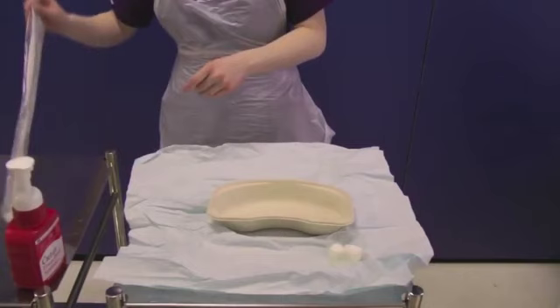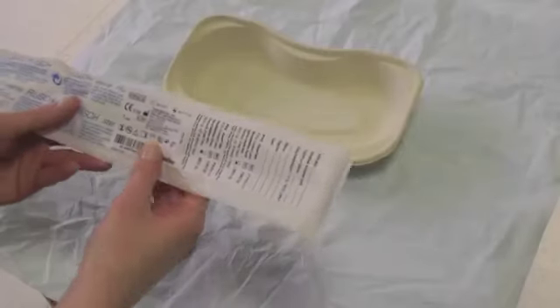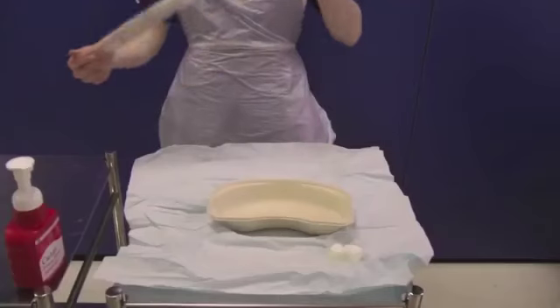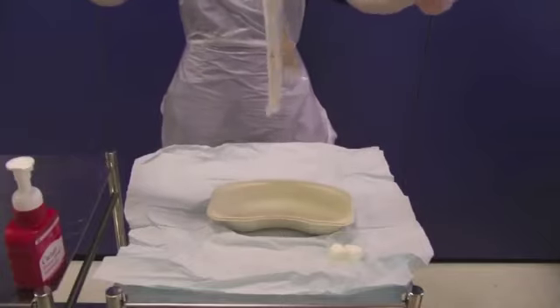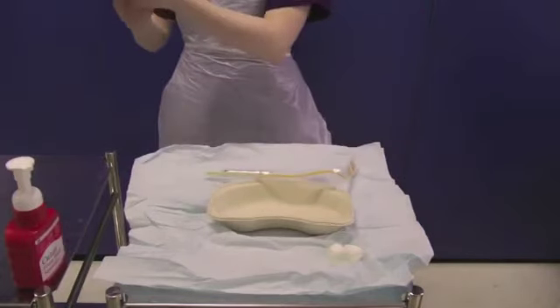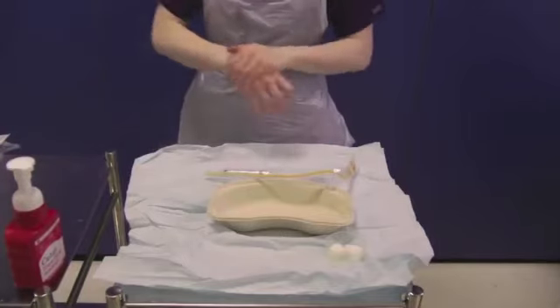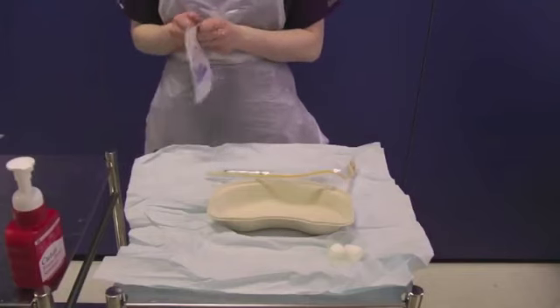Take the selected catheter, ensuring you have the correct size. Check the expiry date and note the stickers on the catheter pack that must be saved for use in the notes later. You can use both a standard size and a female size catheter in women. In this video, we use a standard size catheter. Open the outer packaging and carefully drop the catheter and syringe onto the sterile field. Be very careful not to touch the sterile field with the non-sterile outer catheter packaging.